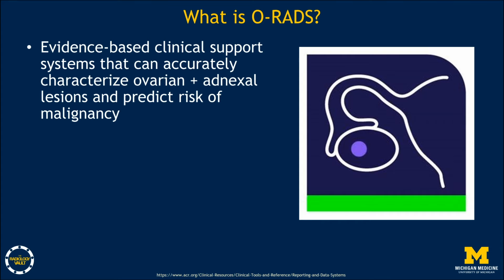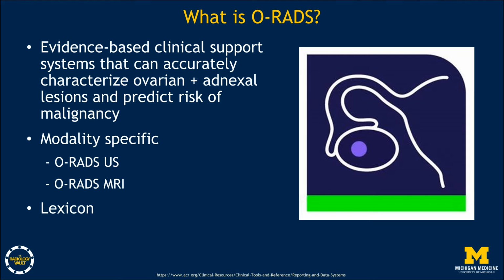O-RADS is an evidence-based clinical support system that can accurately characterize both ovarian and adnexal lesions, and also predict the risk of malignancy based on imaging features. These are modality-specific, one for ultrasound and one for MRI, and they include a lexicon with standardized vocabulary.